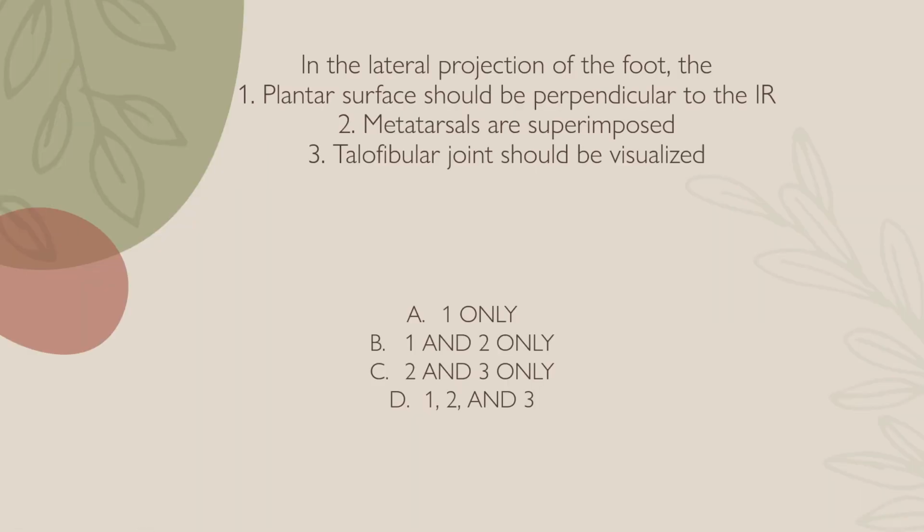Next question is the lateral projection of the foot. The plantar surface should be perpendicular to the IR. Metatarsals are superimposed, or the talofibular joint should be visualized. So our answer is 1 and 2 only. So the plantar surface should be perpendicular to the IR, and the metatarsals are superimposed.